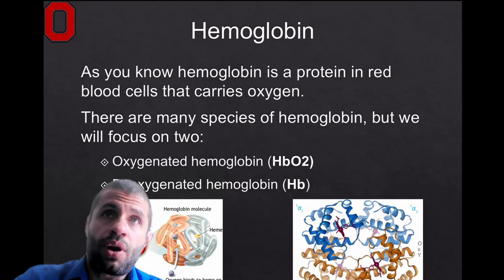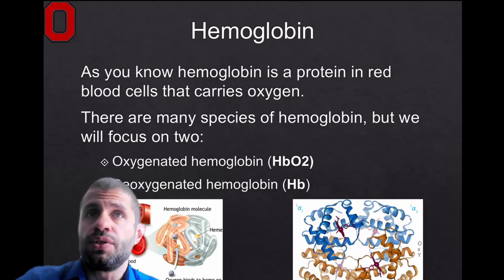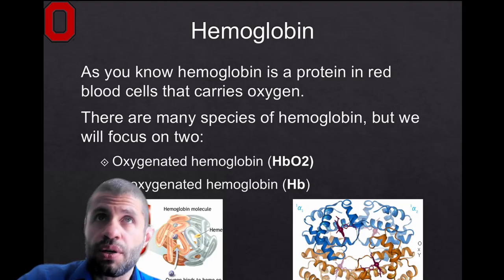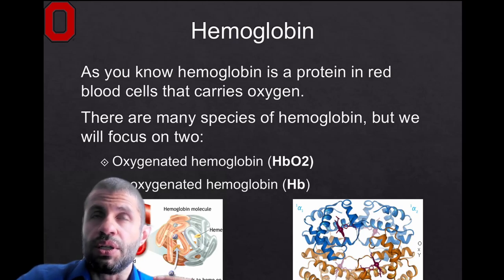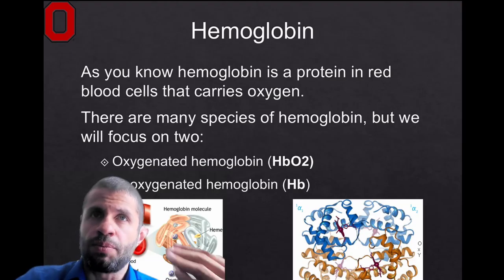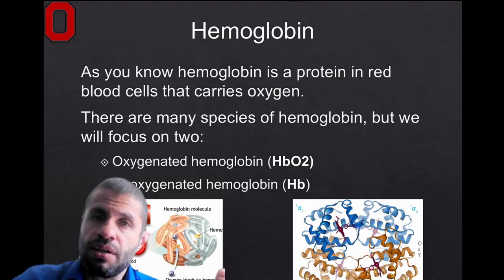And it is the properties of these two proteins that allows us to be able to approximate the oxygen saturation. And hopefully, when I'm already talking about oxygenated, deoxygenated, hopefully already in your mind, gears are turning on how could I approximate the blood oxygenation of a particular individual if I have the amount of oxygenated hemoglobin versus the amount of deoxygenated hemoglobin.